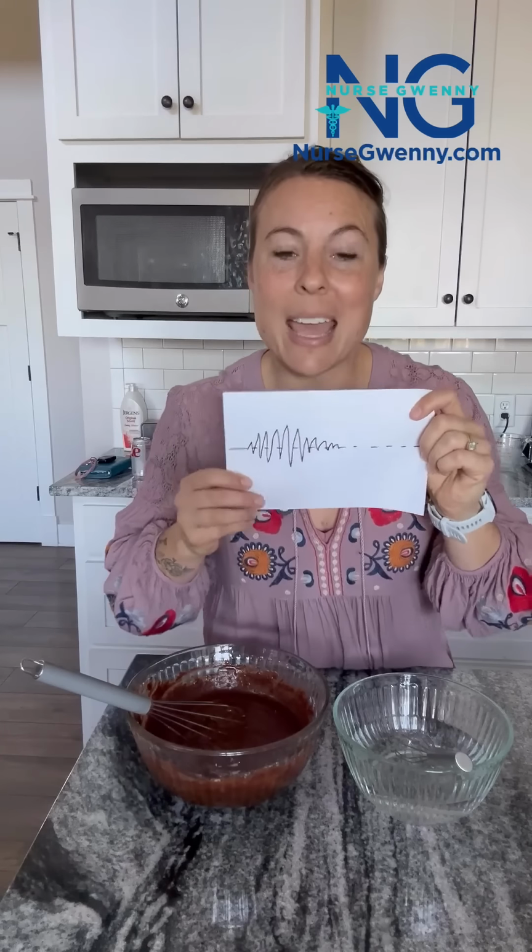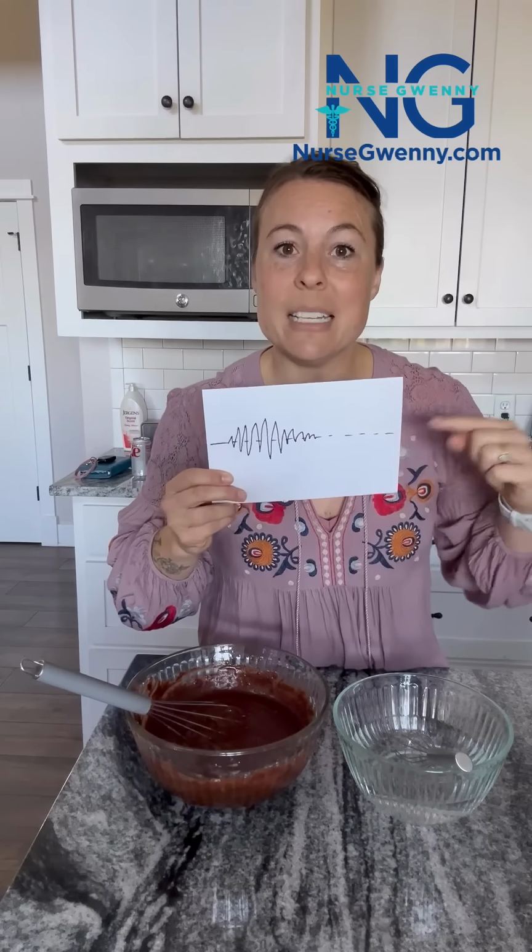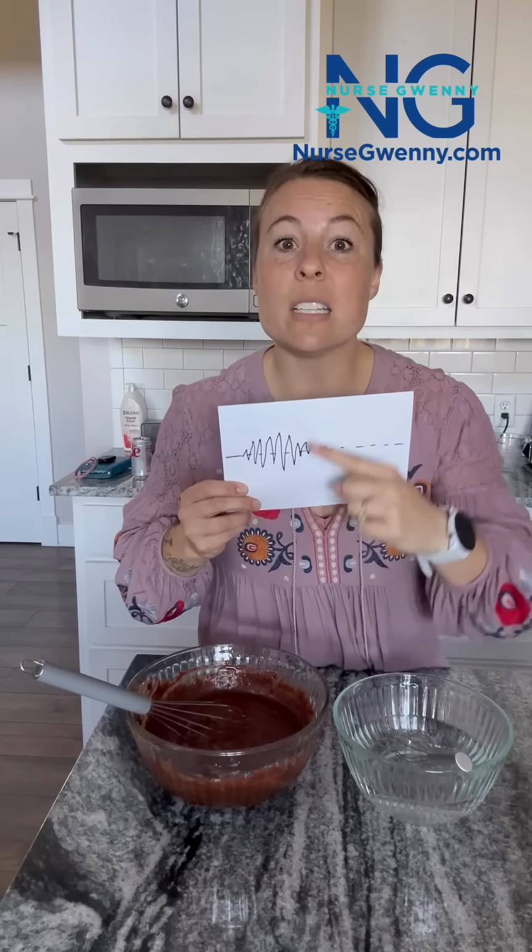Now, how a TEG works is it's kind of like measuring an earthquake with a seismograph, okay? So my x-axis here is going to be time. My y-axis is going to be oscillations. And so what they do is they put a little bit of blood in this little bitty bowl, and then there is like a rod that measures the oscillations.